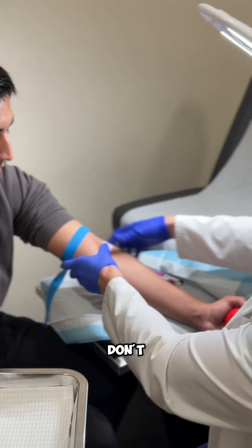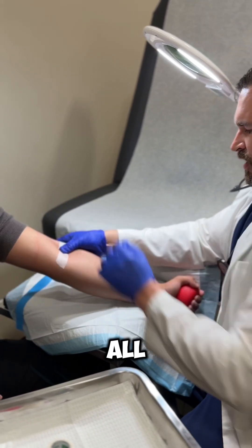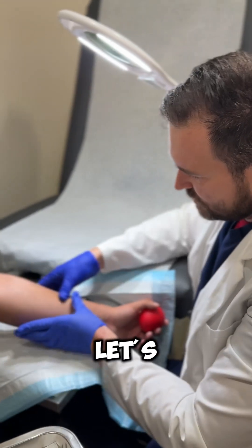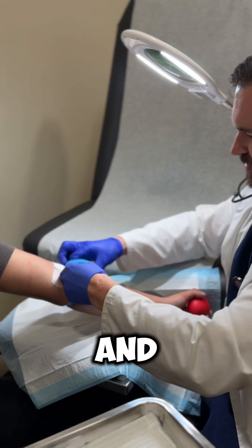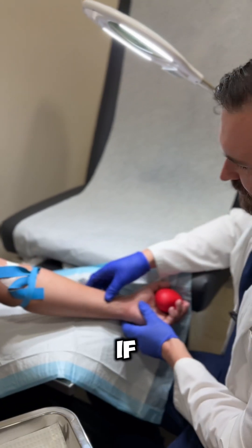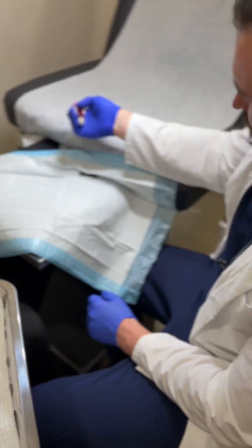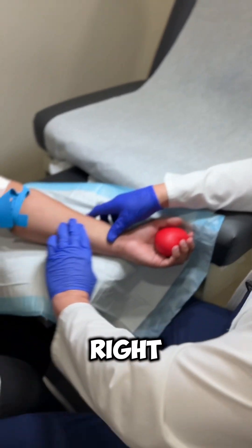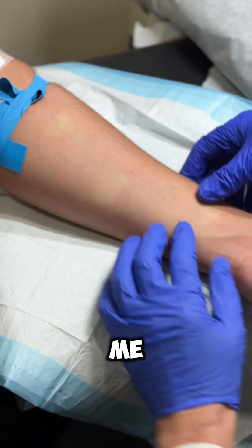Don't bend — just keep it straight and keep the pressure on. What can happen sometimes is the vein might roll over. I'll go a little more here — same thing, nice and tight. If the veins are too small, I have the patient put the arm to the side and squeeze — let gravity work. Squish, squish, squish tight. Now it's going to be a little more full.